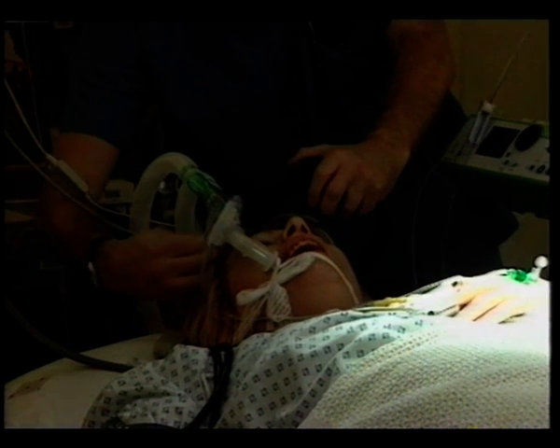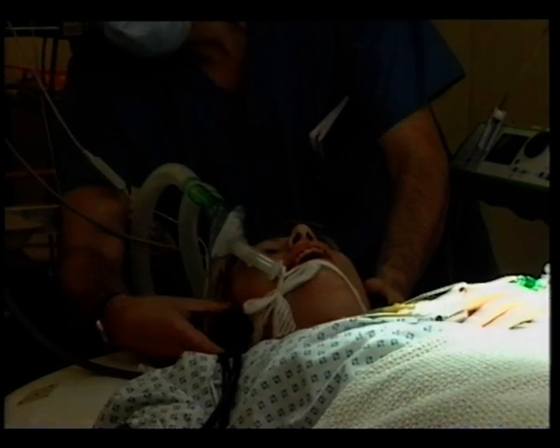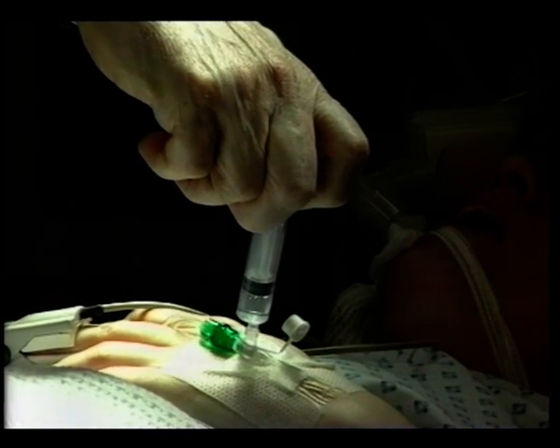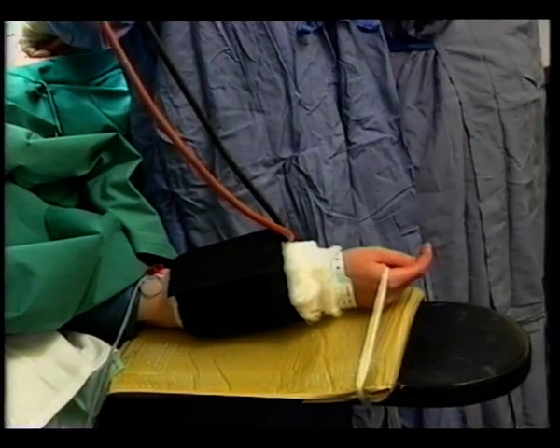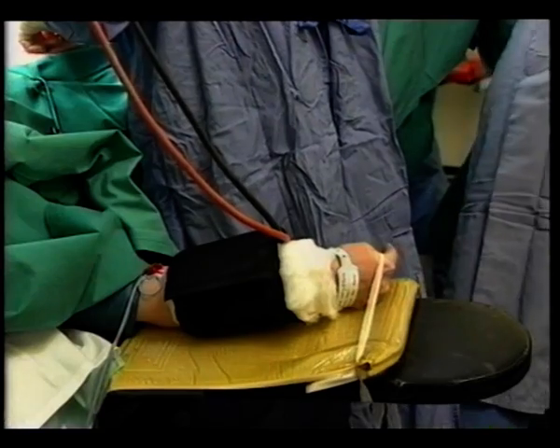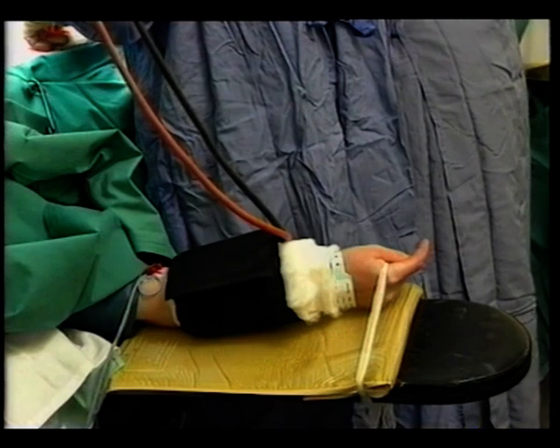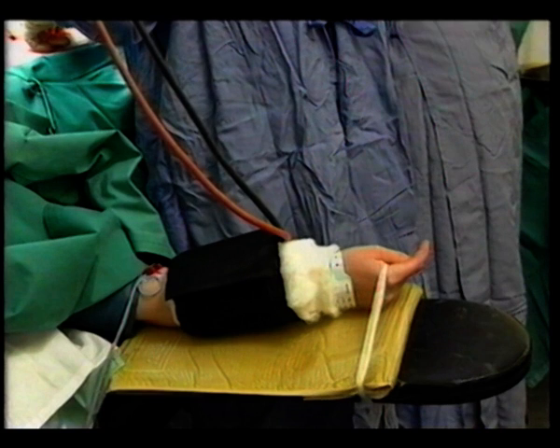The headphones are placed over the patient's ears and the recorded patient commands are initiated. The muscle relaxant is then administered and surgery commences. The integrity of the ulnar and median nerves is checked using train of four stimulation. Nerve integrity is checked regularly while the cuff is inflated — for example, every five minutes with a train of four stimulus or a short tetanic burst.